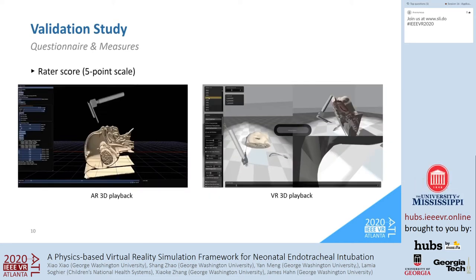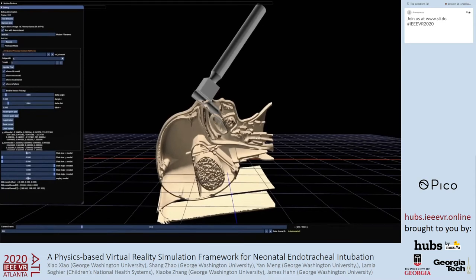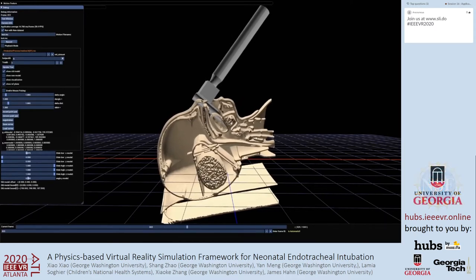After the trials, an expert instructor viewed the 3D playback of motions and rated the performances under the four conditions using the enhanced visualization tools for both systems. In the AR system, the instructor viewed the 3D playback of the motions of the CT scanned virtual counterparts displayed on the computer screen. The motions can be viewed from any viewpoint.